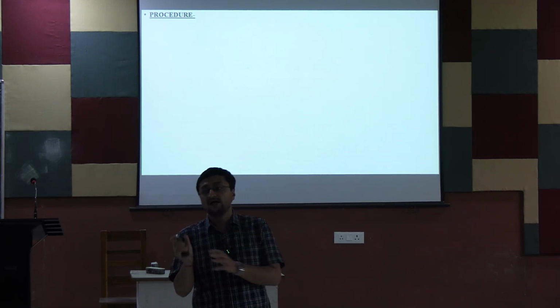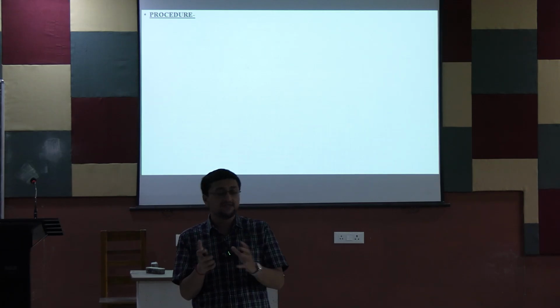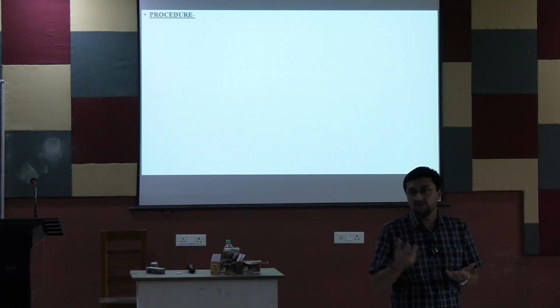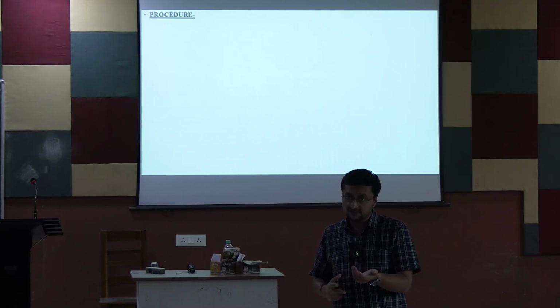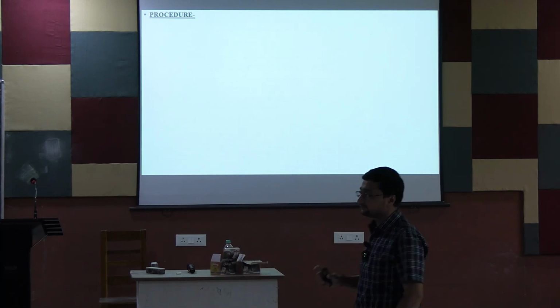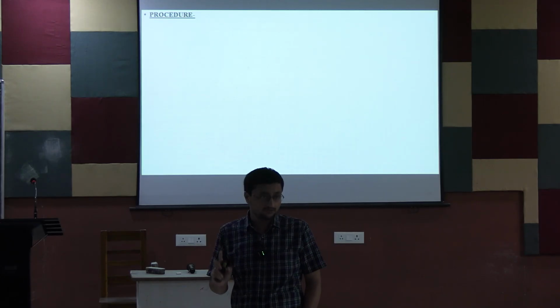Because suppose the ulnar artery is not patent and you puncture the radial artery and it gets thrombosed, then a catastrophe will happen. The palmar area will not get enough blood supply and it will form gangrene, and even the worst may happen, that amputation will occur from the wrist area. So always check whether the collateral circulation with the ulnar artery is patent or not.